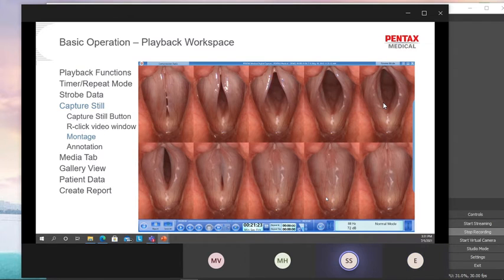So there's no other competition that's able to do this. So we can actually tell people quite confidently that we can really know whether the vocal folds are being closed tightly because of the montage, right? There are competitors telling the customers that they are able to measure the gaps, etc. Well, good, you can measure the gaps, but can you tell whether the glottal cycle is being closed properly? With these questions, you'll probably win them.